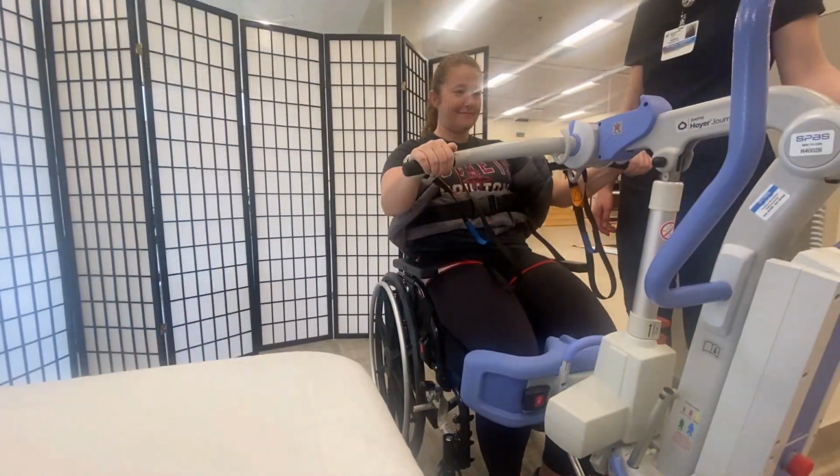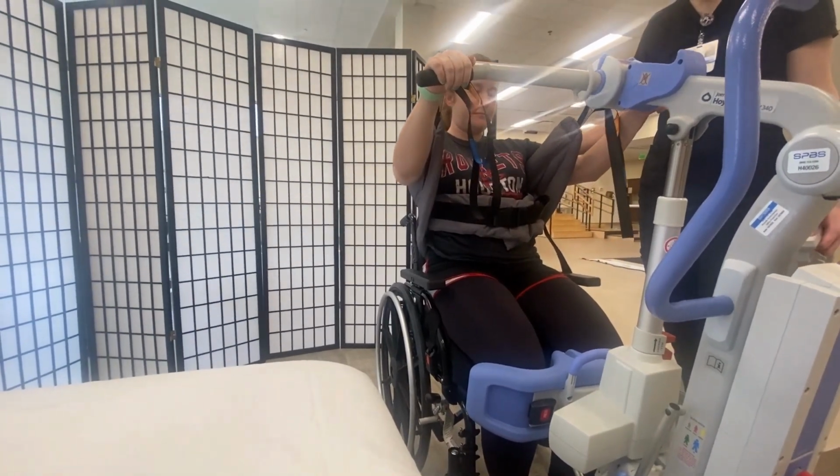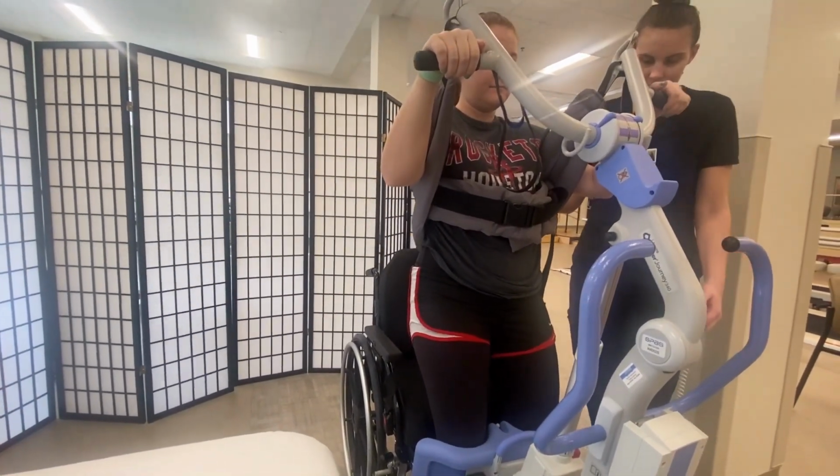The benefit of the powered stander is that with the harness, the lower half of the patient is free, which allows for easier ability to complete wound care, lower body dressing, or toileting hygiene while in the standing position.